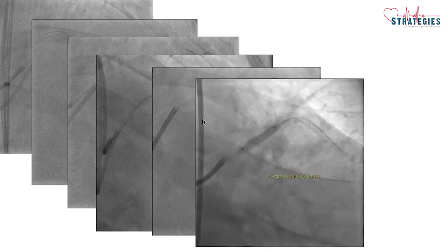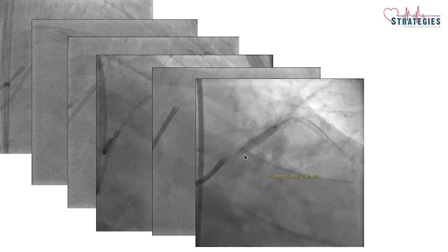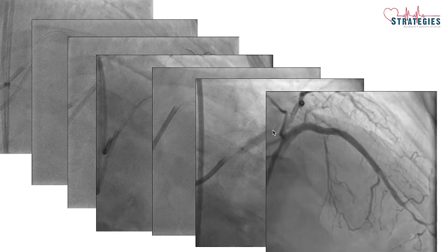So we took a 3x38 stent, as IVUS showed distal vessel as 3 millimeter. This is a 3x38 Promus Premier, and proximal size according to IVUS was almost 4, so I took a 4x18 Promus Premier proximally with overlapping stenting. And this is after stenting.